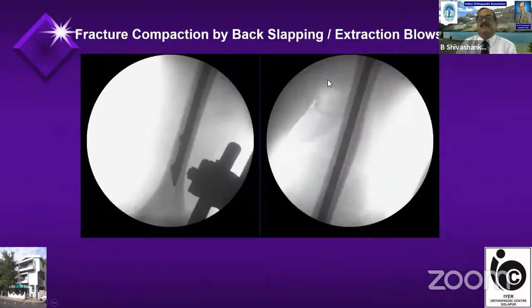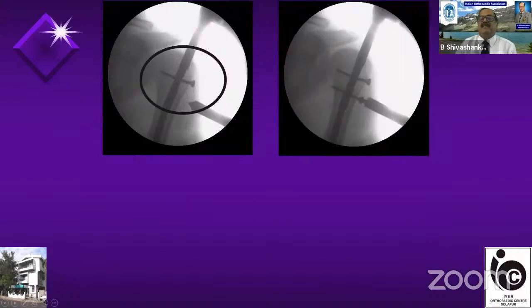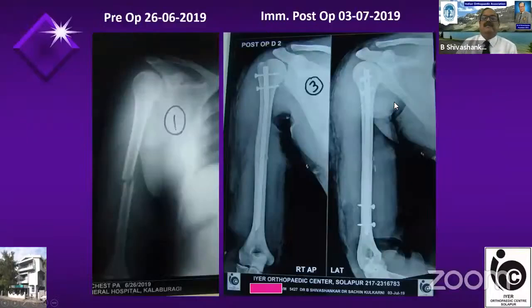As you can see in this case, the fracture has been compacted. Then I will go ahead and do the proximal locking. And when I do the proximal locking, I always see that the nail is well buried, at least about 5 to 7 millimeters underneath the bone. See, at the end of the surgery, 2 small incisions for proximal locking. This is the 8 millimeter incision for the nail to be inserted.